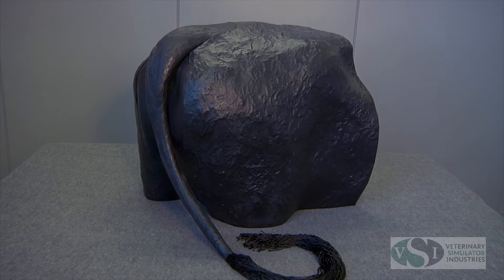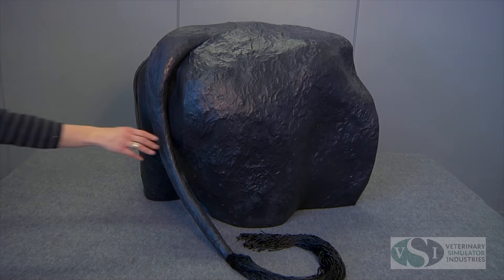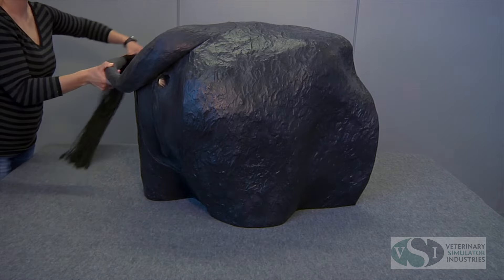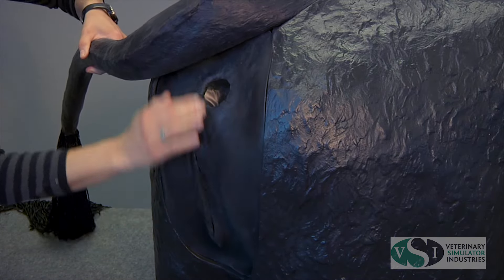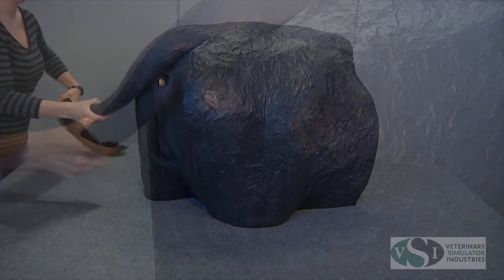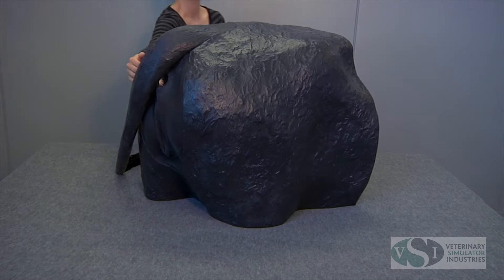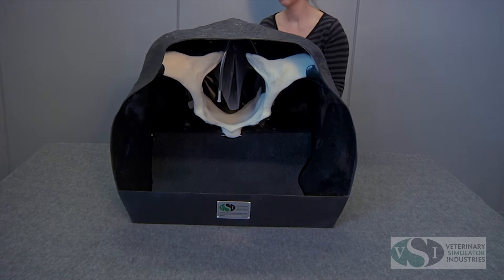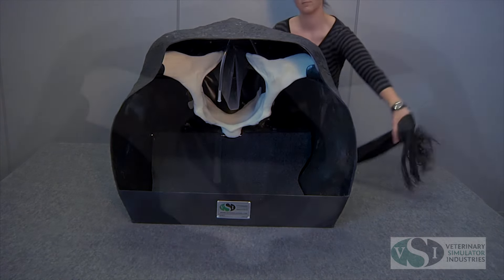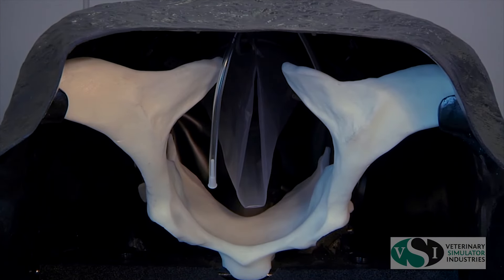The VSI bovine theriogenology model with the VSI bovine uterus set is constructed from durable epoxy and fiberglass, with the bovine uterus set made from natural latex rubber. Designed to be used as a tabletop model, the simulator comes in a standard black color with the bovine pelvis, tail, soft perineum panel, and inflatable rectum already assembled. The rectum consists of an inflatable cuff in an effort to simulate the pressure felt on the arm during palpation.